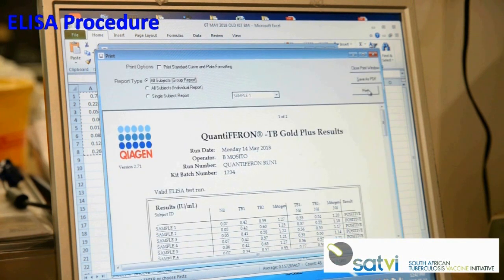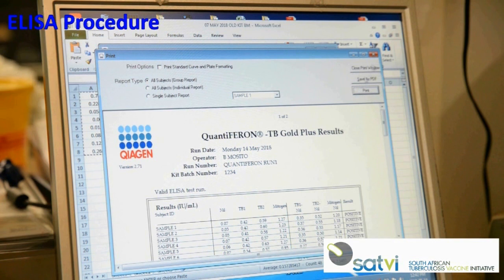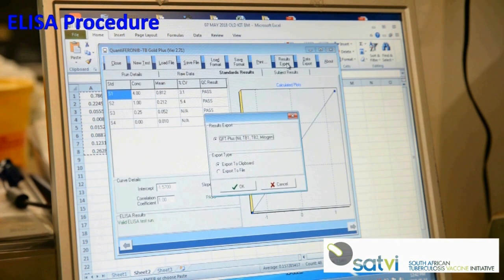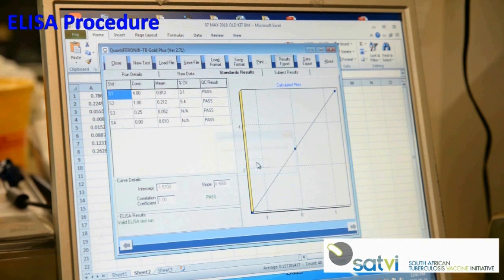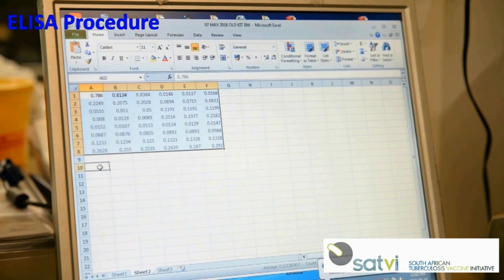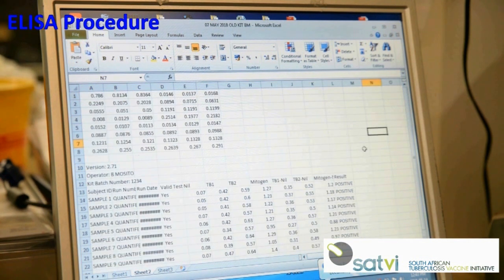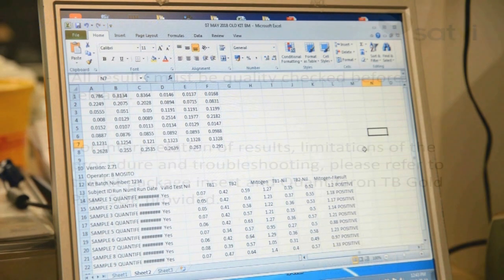Results can also be saved as a PDF. To export results, close the print window and select Results Export, then select QuantiFERON Plus. Under Export Type, select Export to clipboard file. Paste the results into the Excel spreadsheet containing the ODs. All results must be checked by a supervisor before release.